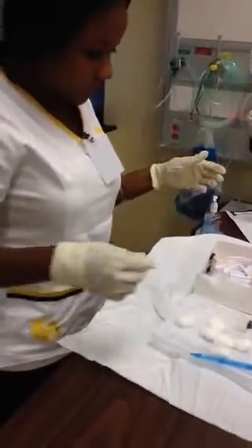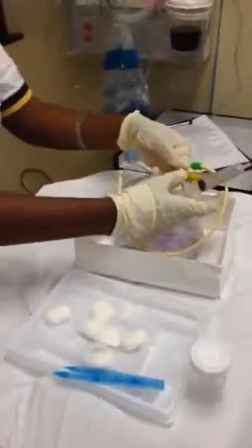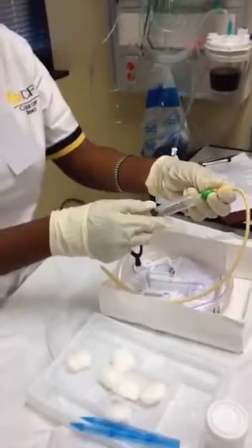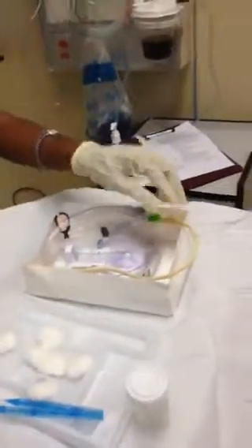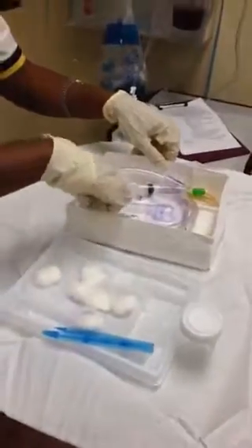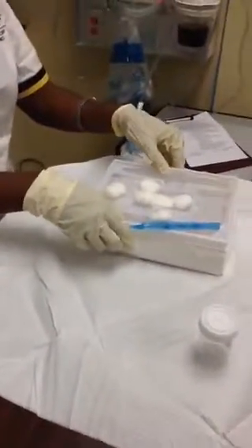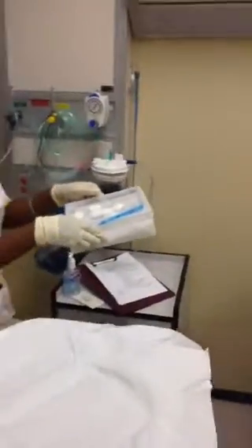Okay, so now I'm going to take the syringe and insert it into the catheter so I can have everything ready. Okay. So now that I have everything, I can take them together to the patient. I can move this out of the way because I'm not going to use it.